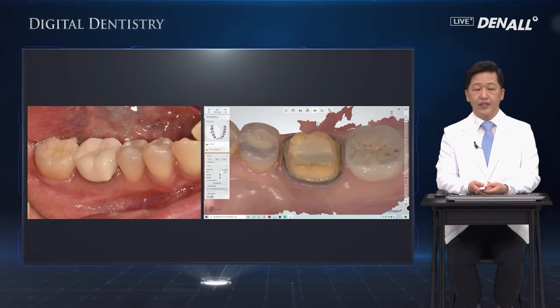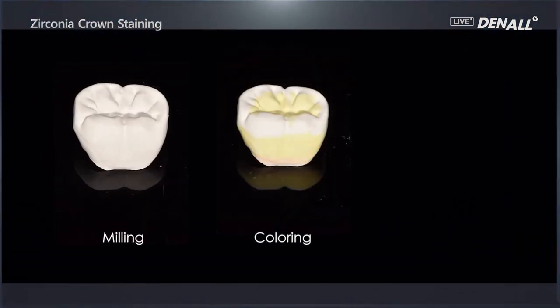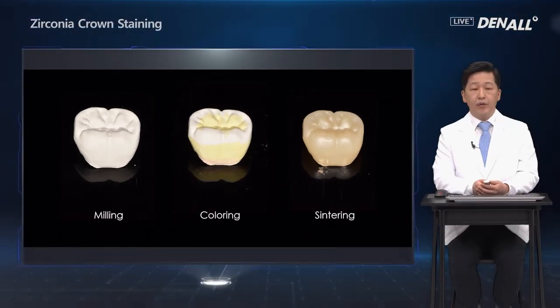It is milled. This is the coloring before sintering. After sintering, it looks like this. Using the Mio kit, let me show you how to do the staining.